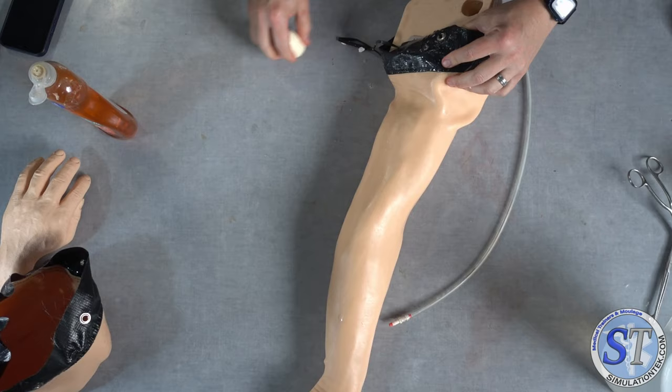We're almost there. From now on, what we got to do is just kind of adjust things a little bit. Make sure that everything seats well. Probably got about another inch or two to get those fingertips in. But for the most part, that's how to do this. I hope this helps out.